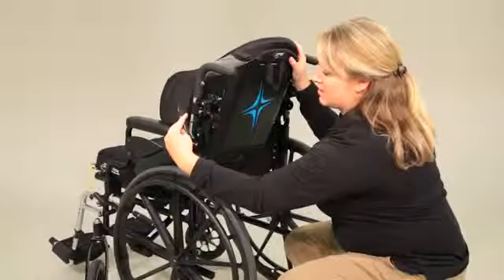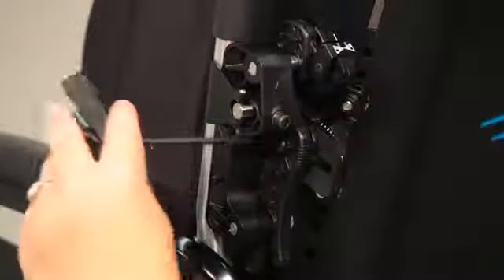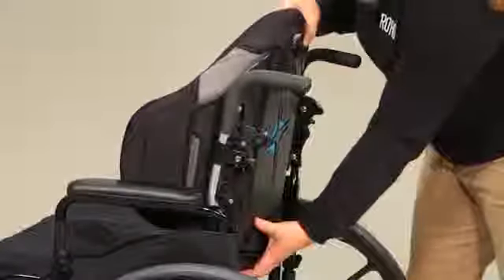Loosen the left and right depth adjustment angle bolts with the Allen wrench. 2 to 3 full rotations to adjust the seat depth. 1 to 2 full rotations to adjust the angle only. To adjust the seat depth, slide the back shell forward or backward to the desired depth.